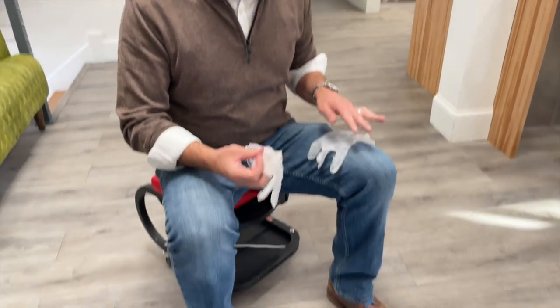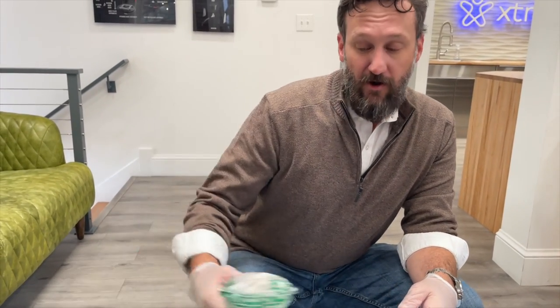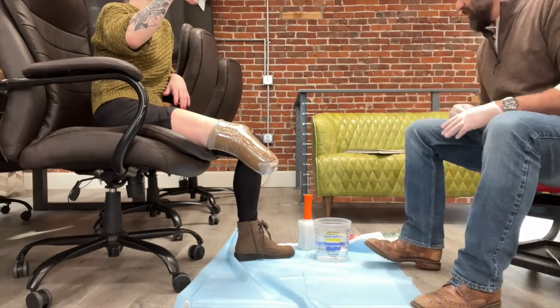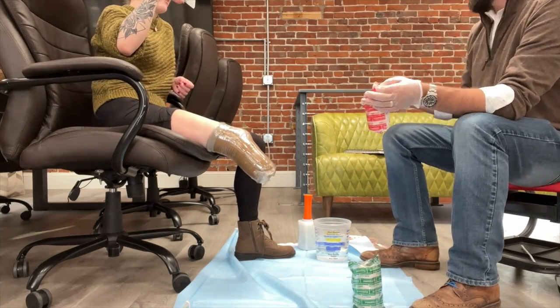I kind of compare it to cars. So pinlock is kind of like a pickup truck. It's easy, right? You hear the click, you know it's locked in, it's not falling off. The nice thing about pinlocks is they're very durable. Suction and vacuum systems are much heavier maintenance. Like I was saying earlier, every amputee is different, every body is different. You just gotta find what works for you, so we're gonna give this a shot.